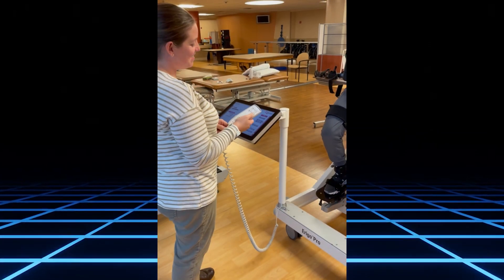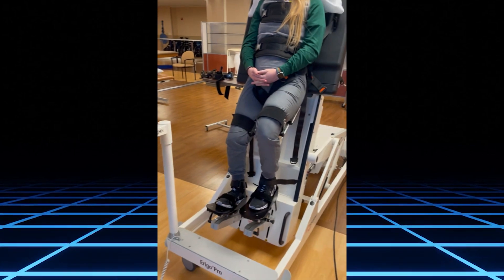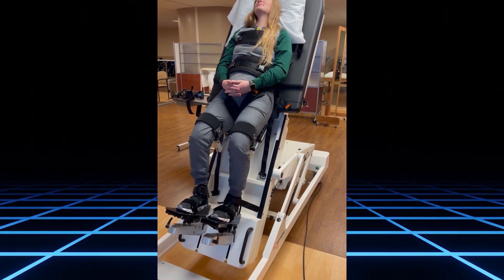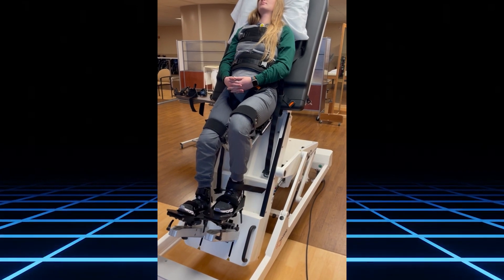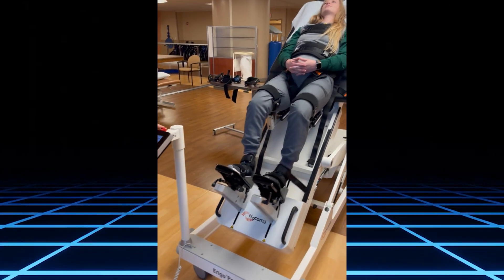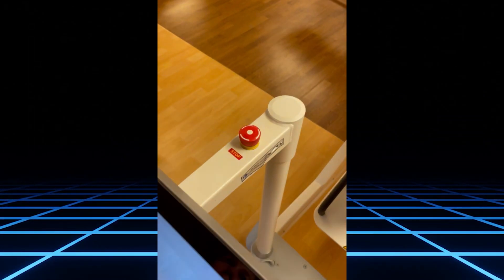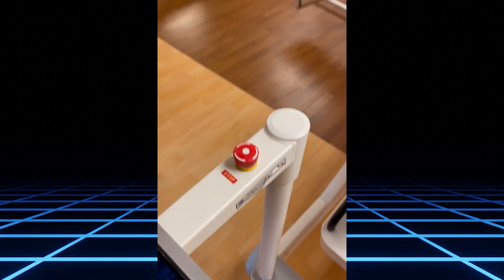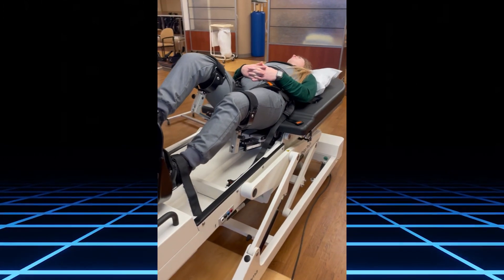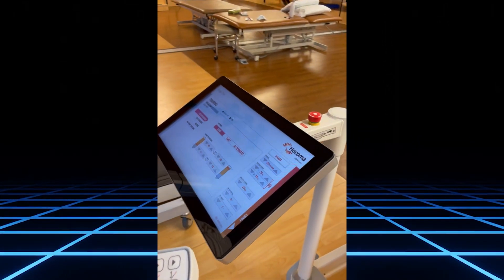Once the session is done, have the patient come down gradually — that's always best. While she's coming down, I'll point out the emergency stop in case anything were to go wrong. Once she is fully down, you can stop the machine on the computer by pressing Stop.